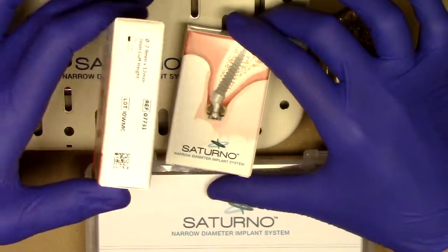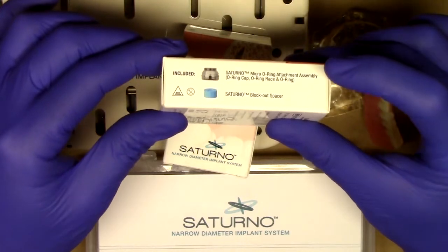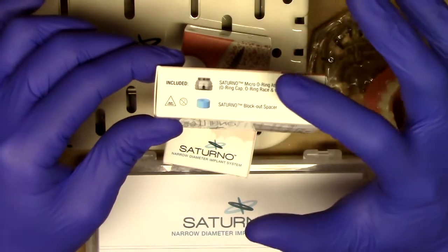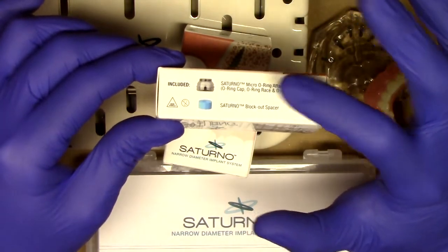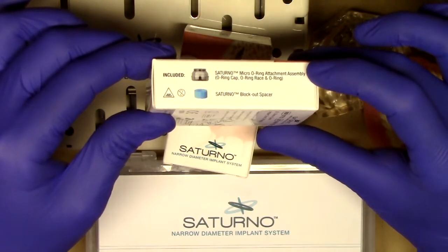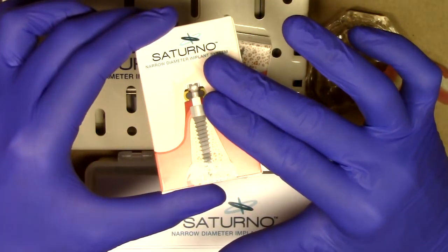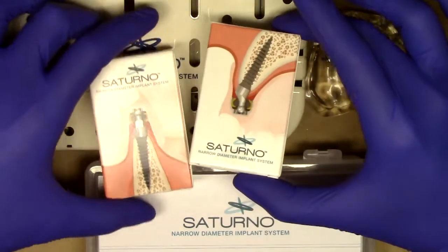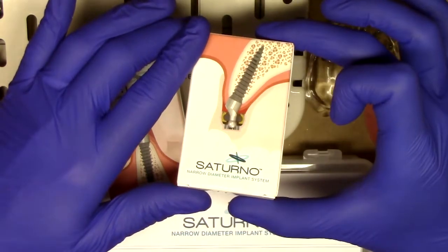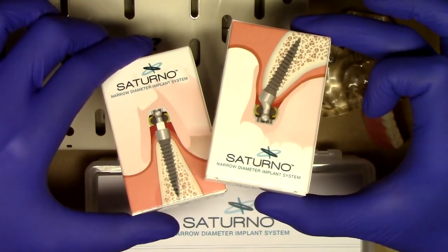The entire packaging also comes with everything that you would need, very similar to what you've been experiencing with the Lodi system, including the housing as well as a blockout spacer. Inside of the housing there is an o-ring cap, race, and o-ring itself. That Saturno patented pivoting connection is a really wonderful design, especially for off-axis implants. This is all included for one low price. For just a little bit more money, you can get the angled Saturno narrow diameter implant, and both of these are very appropriately priced for your patients.